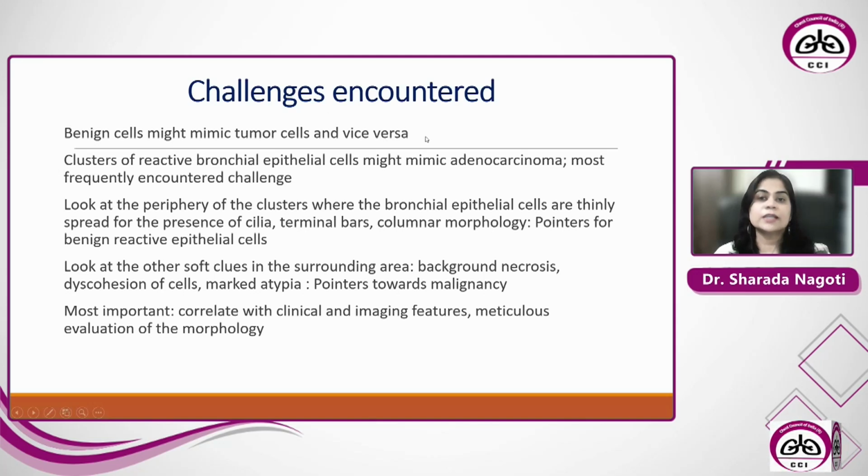So coming to some of the challenges which are encountered in ROSE, benign cells might mimic tumor cells and vice versa also can happen. Clusters of reactive bronchial epithelial cells might mimic adenocarcinoma. This is the most frequently encountered challenge.